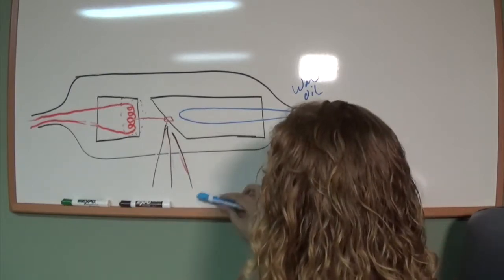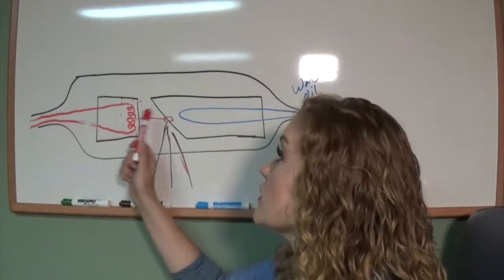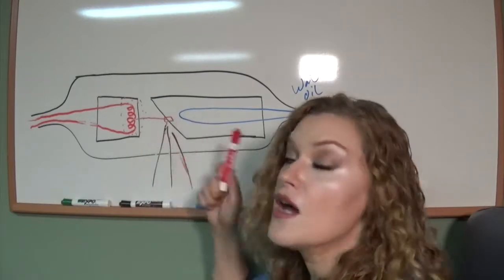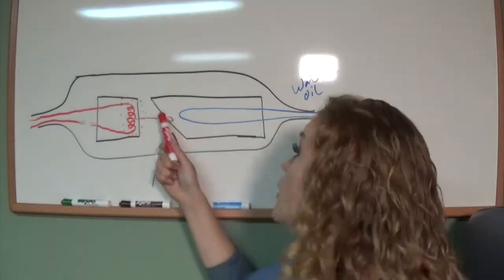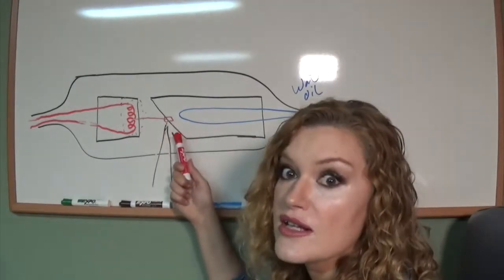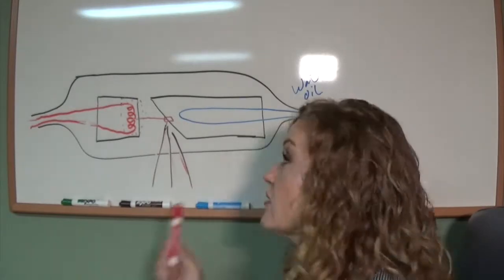So some of the other parts that we didn't talk about: we talked about the tungsten filament, which is what's going to heat up when you go into standby mode. We also talked about the tungsten target on the anode. That's where X-rays are actually produced. And 99% of the energy produced is going to be heat. Only 1% is going to be X-rays.